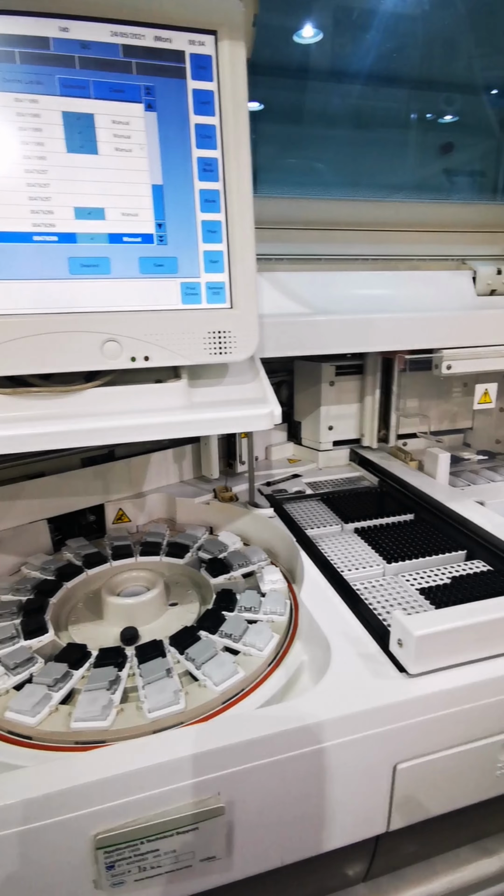Now click QC, then you will see the position assignment button. Position assignment means that you will select a position for each of the control that you will make. Press position assignment, then control. Then you have to select which control you are going to do.